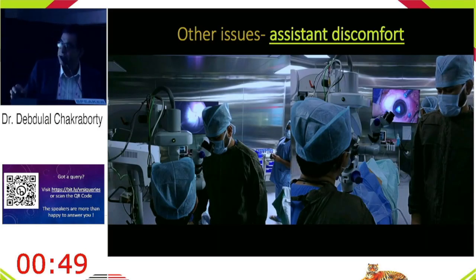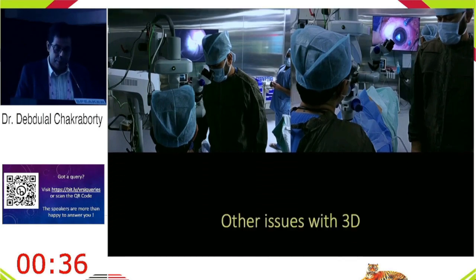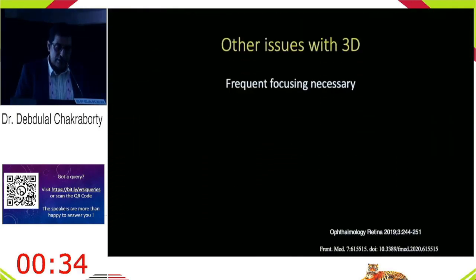One very important factor that my friend missed out was the assistant's discomfort. I've had this with different assistants, fellows who really find it difficult to assist a buckle on the 3D. They really find it difficult to do a scleral indentation on 3D. So let's move on. There are other issues as well.